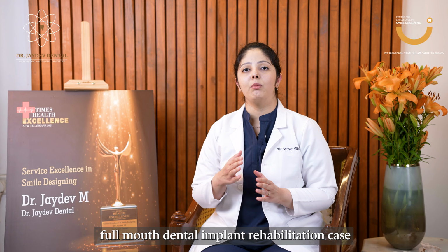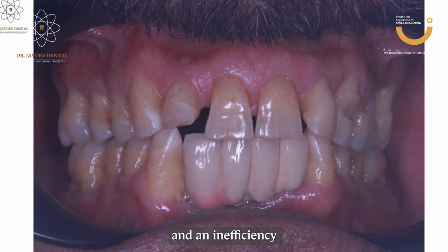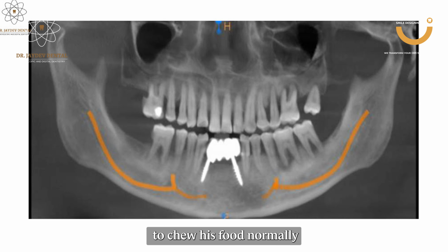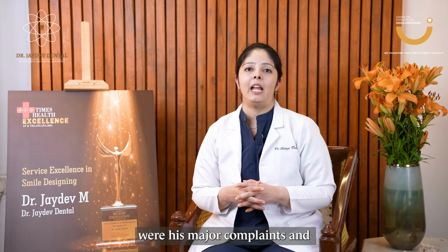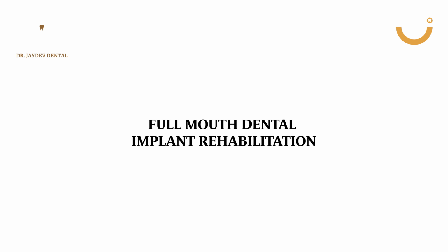Today we are here to discuss yet another full mouth dental implant rehabilitation case. This patient came with a complaint of decreased self-esteem and an inability to chew his food normally. These two were his major complaints, and a full mouth dental rehabilitation treatment plan was suggested to him.